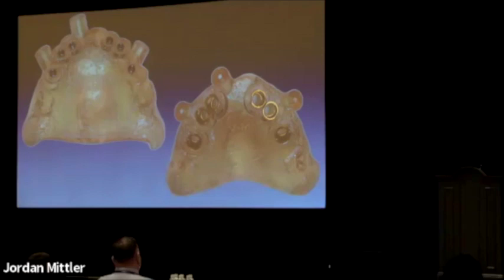Remember, we did not immediately load here. We're using immediate dentures, but I still want good primary stability of those implants because I'm placing 12 implants. The fewer of them that fail, the better. So osteodensification is nice. So we got a 2mm twist drill guide on one side, and then I have the Versa guide on the other.